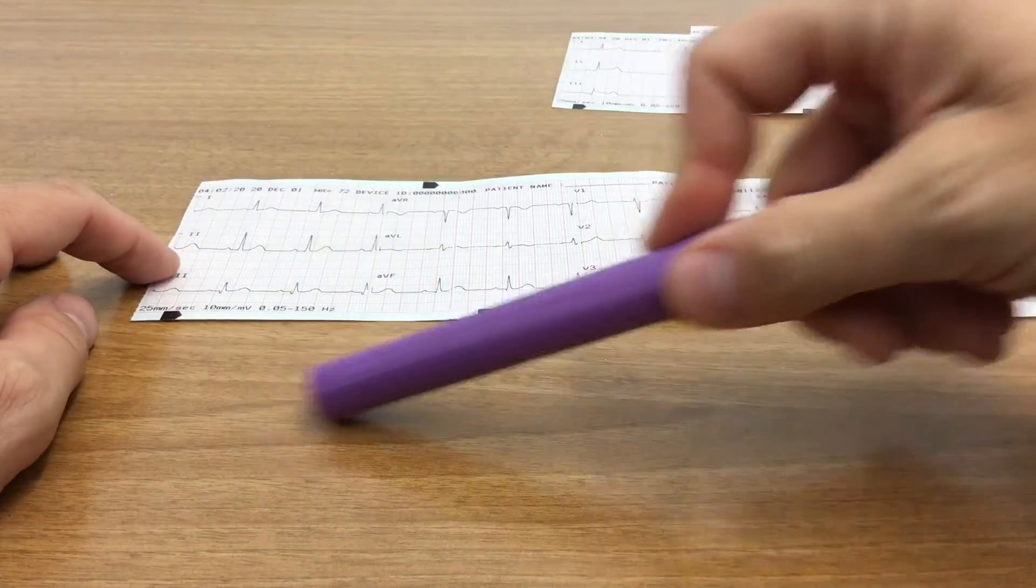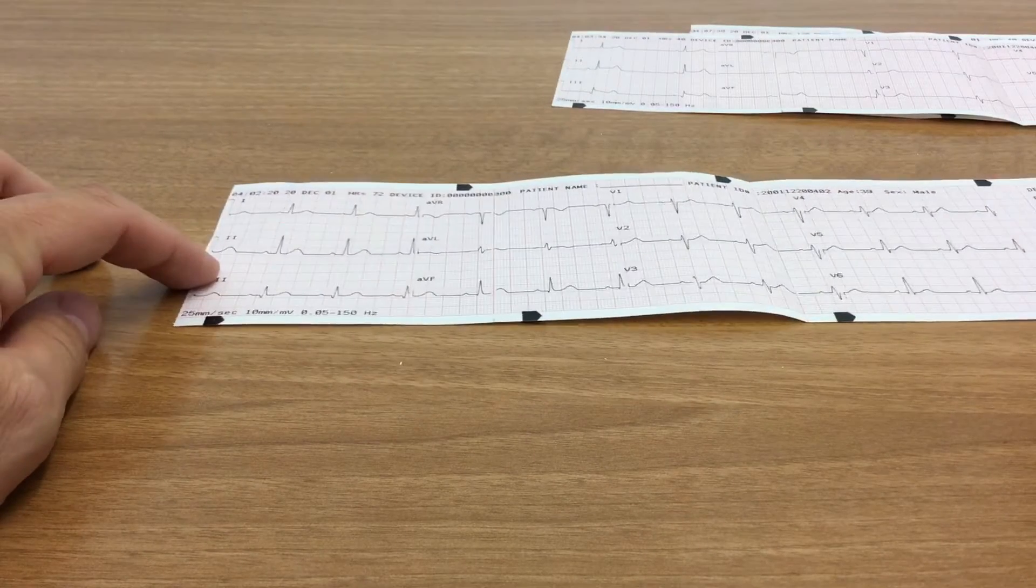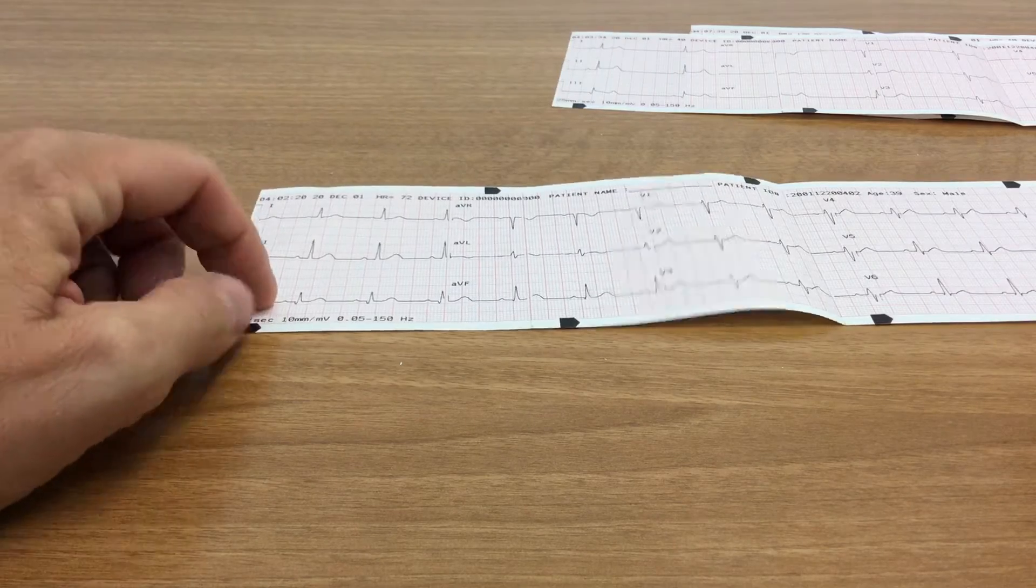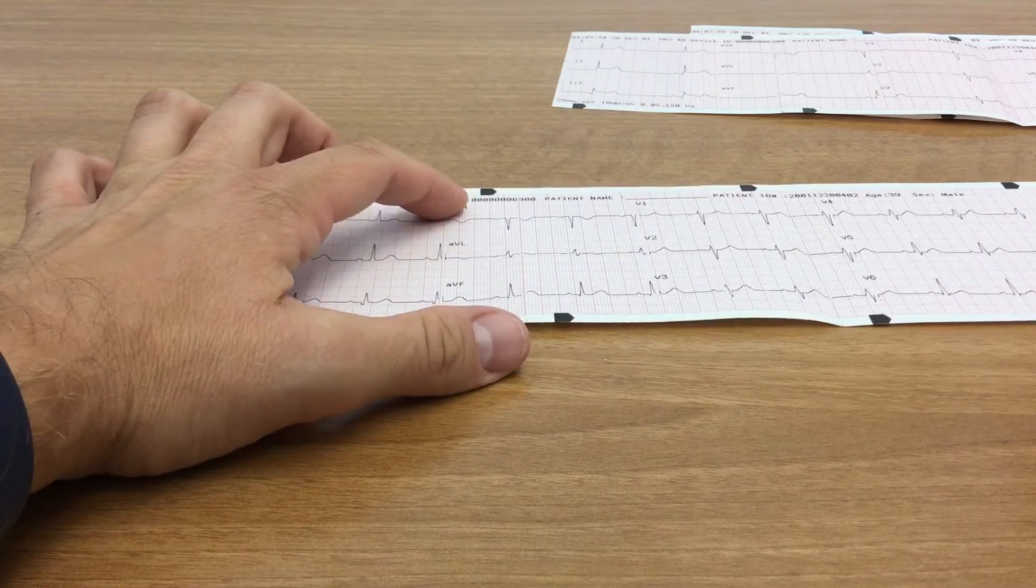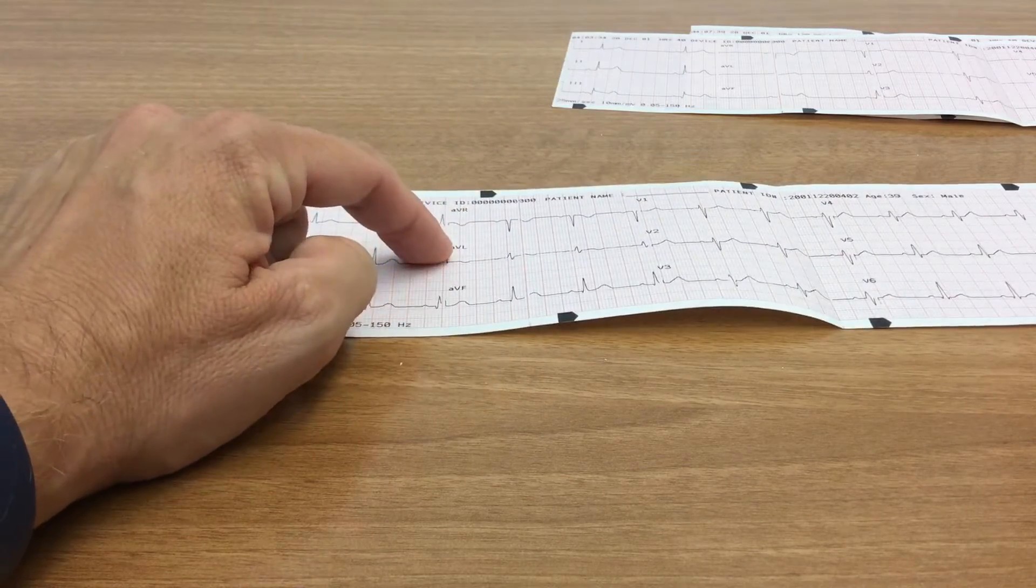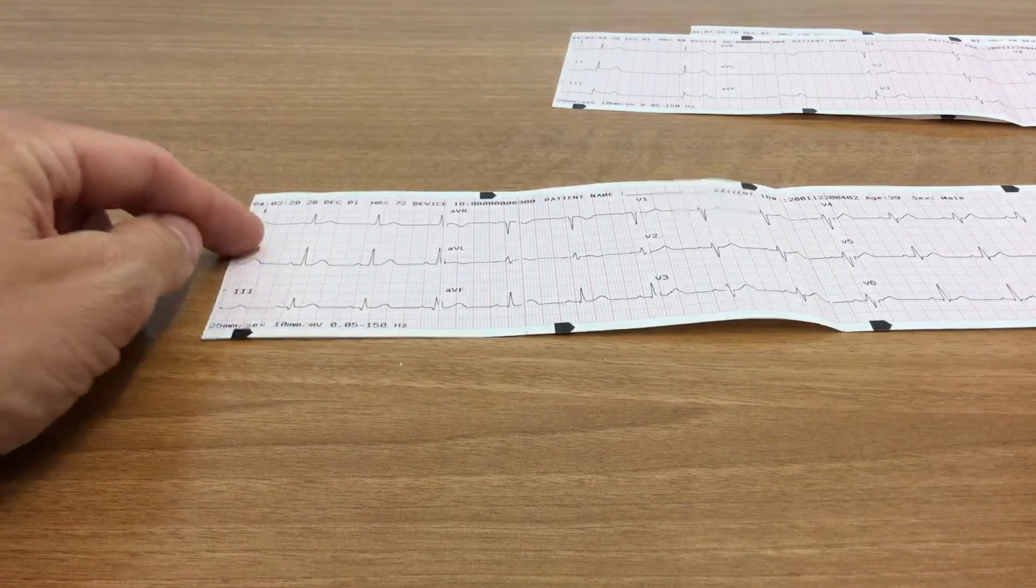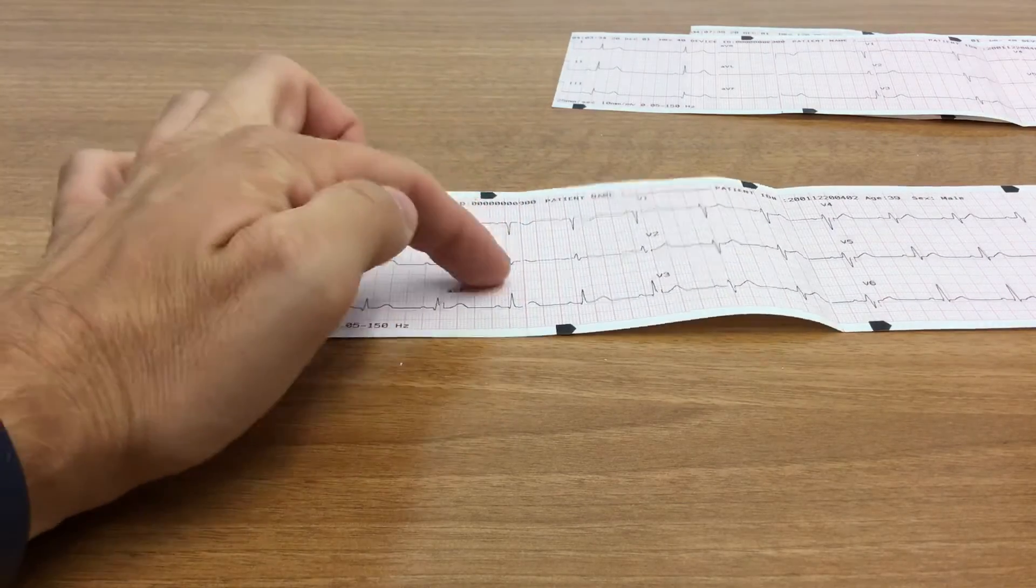Some have a rhythm strip associated with them, but these are your standard lead configurations. So you have lead one, two, three, augmented vector right, augmented vector left, and augmented vector foot. So AVR, AVL, AVF, right? So one, two, three, AVR, AVL, AVF.